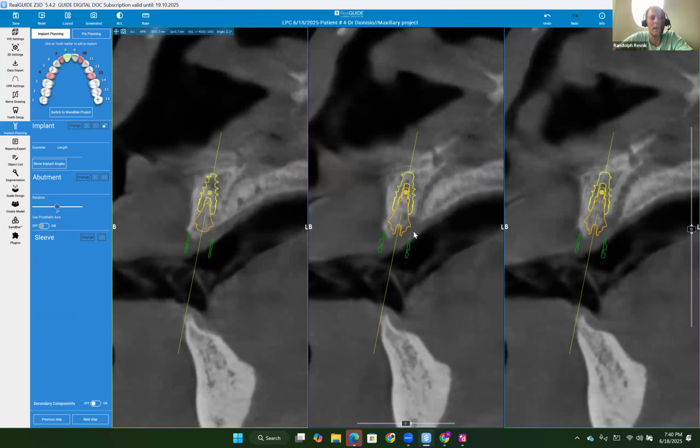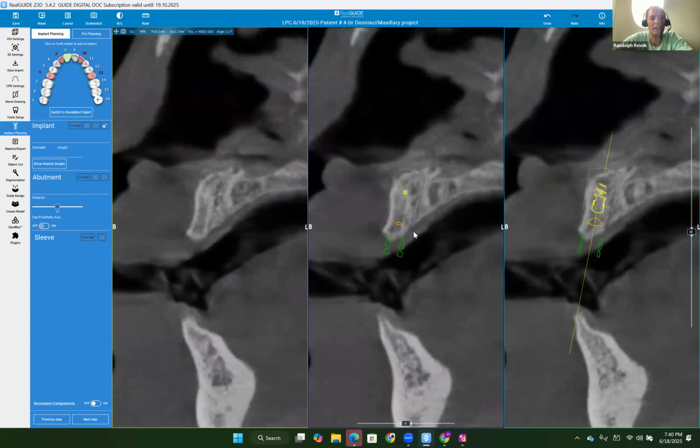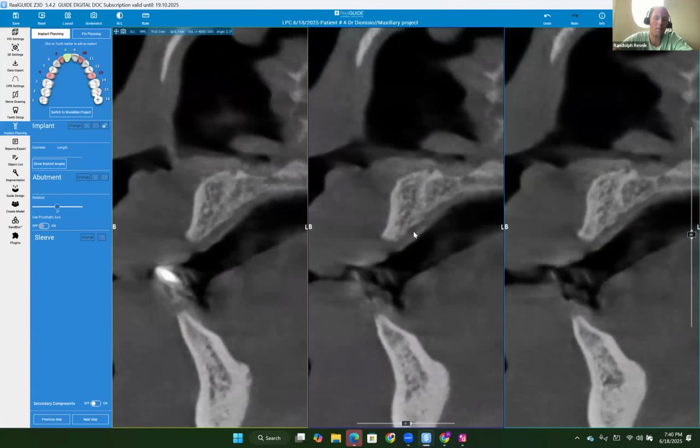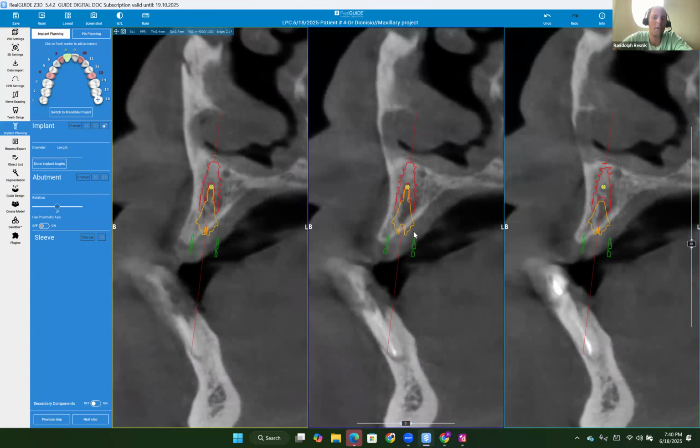So it's going to be very difficult to gain with. So go back here, Hussein. Go back a little further there. So right there. Where he has this implant placed here, you wouldn't really need to do augmentation. You're doing plasty to the level of it. Depending on where the incisal edge is on your digital smile design is going to dictate whether you need ridge augmentation or you'll need plasty here.